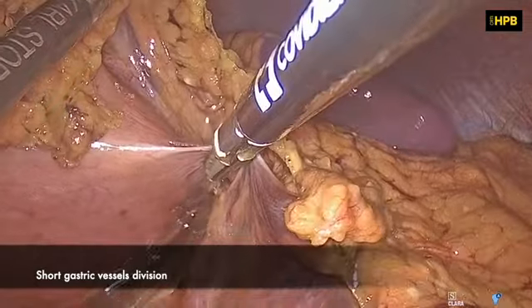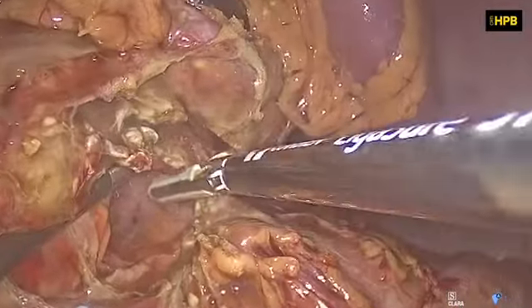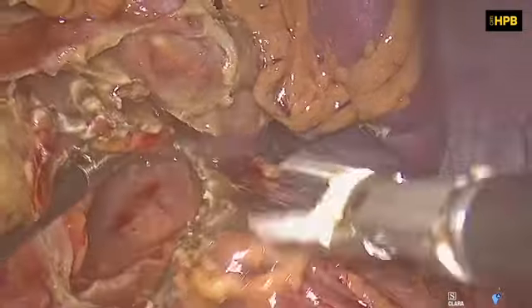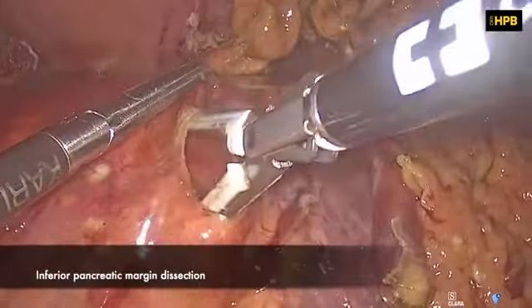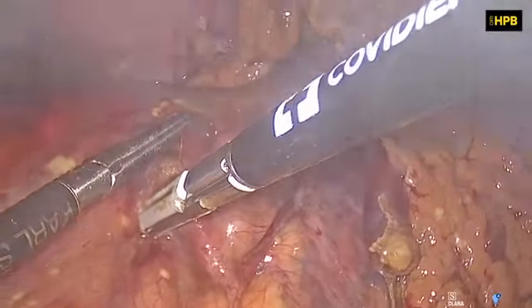Surgery continued with a section of the short gastric vessels and splenic flexure mobilization. It can be seen the presence of pancreatic intra-abdominal fluid. In the next steps, the lower and upper edges of the pancreatic gland were dissected.